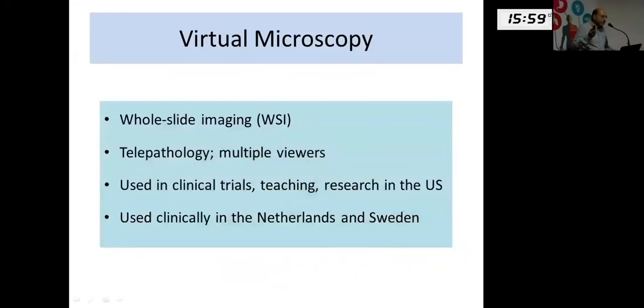Again, shifting track. Virtual microscopy. This is available in different parts of the world. The whole slide can be scanned using very precise mechanisms of slide movement, and the scanned information can be stored and sent across to different parts of the world. So much so the slide, in the glass format, physical format, can be removed, and the scanned information can be seen in America or wherever else you wish an expert to look at and give you comments on.